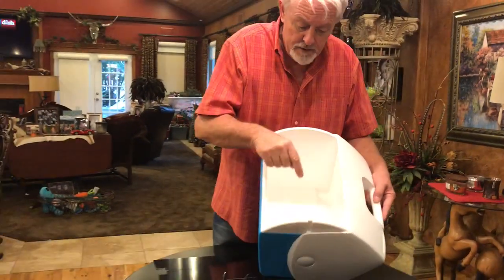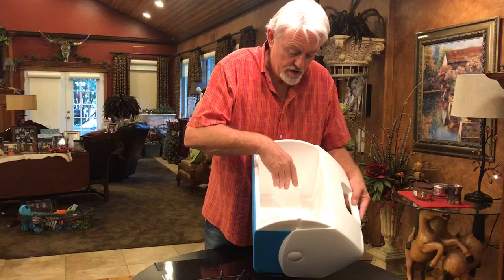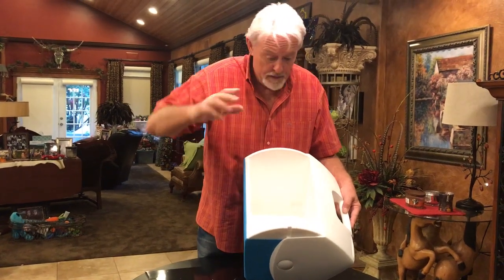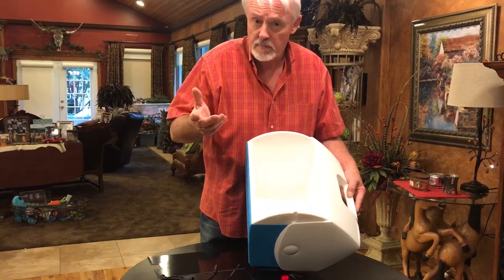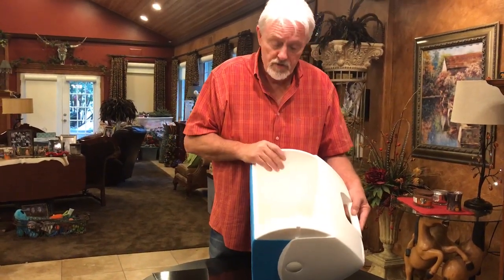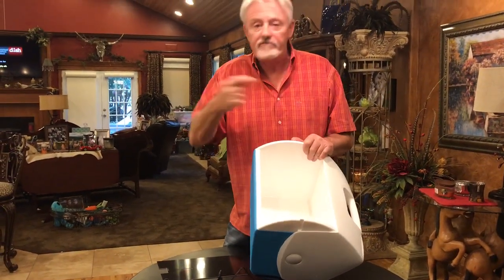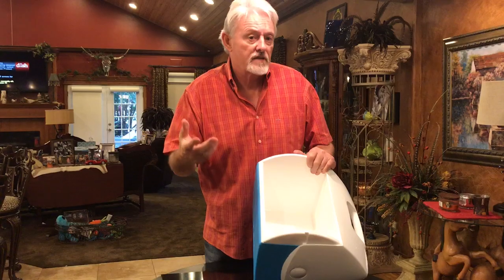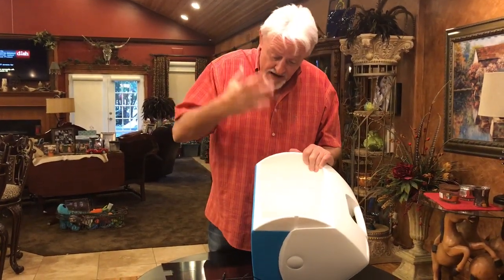So if you've got a puppy that's pooped, or there's some blood products, or it's urinated, or it's vomited, you can just take a paper towel and some Windex or some cleaning Lysol supplies. 99% Lysol, exactly. Spray this thing down, wipe it out, and you're good to go. Most of them have air vents and filters and all kinds of other stuff that get muck in them. The heat's coming up through the floor, and it's inherently safe.